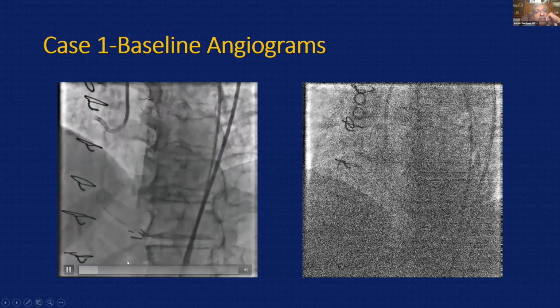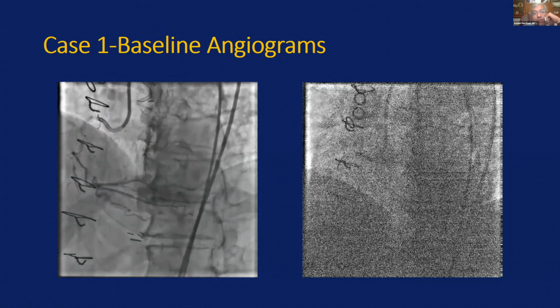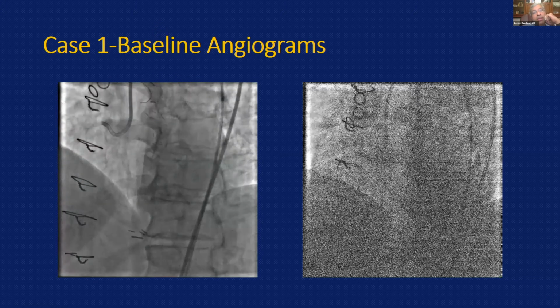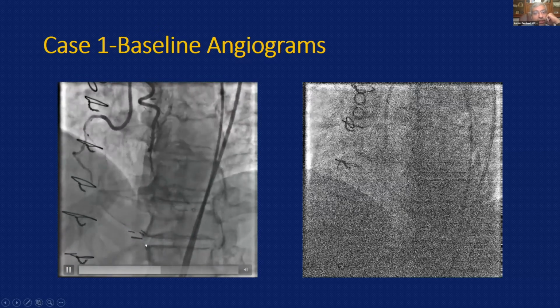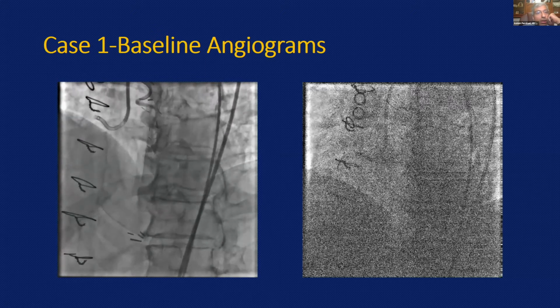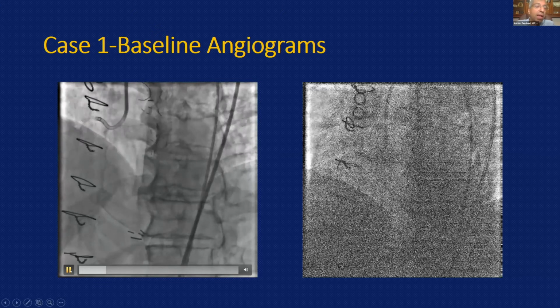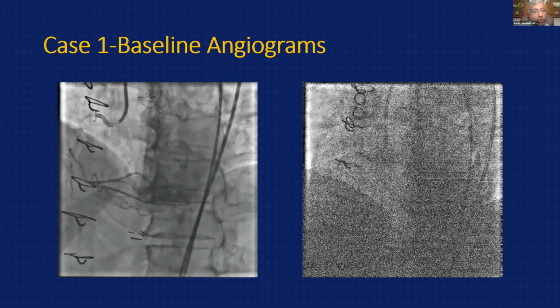In the past, this is a slam dunk retrograde case if you have a good retrograde option. Obviously, with the emerging data that retrograde PCI, especially through a LIMA, potentially has increased risks, and the absence of ability to go retrograde, if the skill set is lacking by the CTO operator, then plan B in most instances here would be a high-end ADR if you can do a stick and swap just proximal to the bifurcation. Or if you're not so lucky, then maybe a bifurcational ADR approach into one of the branches and then potentially a mini star into the other branch to optimize the outcomes.